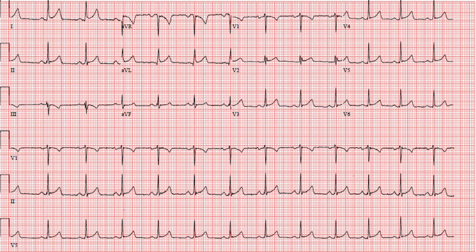This is a 12-lead EKG. We have lead 1, 2, 3, lead AVR, AVL, AVF — that's 6. Then leads V1, V2, V3, V4, V5, and V6. And if we do some simple math, that adds up to 12 different leads.